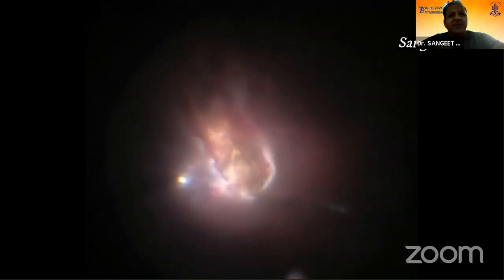And then again, we excised the choroid using the vitrectomy cutter. The choroid as well as the retina and the overlying fibrous tissue was excised. There was some bleeding happening, but it was easily controlled by using diathermy and by raising the bottle height. And you see, once we had excised the choroid, the foreign body was just lying below the choroid.